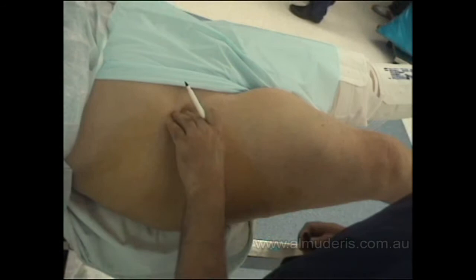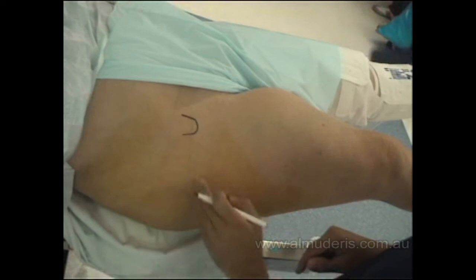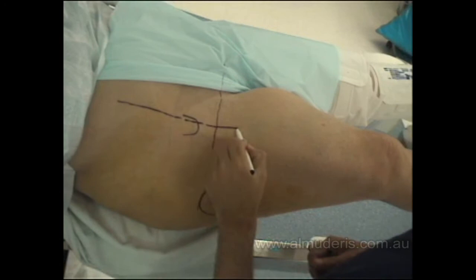Hip arthroscopy is done on a traction table. I start by identifying the landmarks. The first landmark is the anterior superior iliac spine — the patient is positioned supine. The greater trochanter is the second landmark and the pubic symphysis is the third. A horizontal line is drawn from the pubic symphysis to the greater trochanter, and a vertical line is drawn from the anterior superior iliac spine directed down to the knee joint.